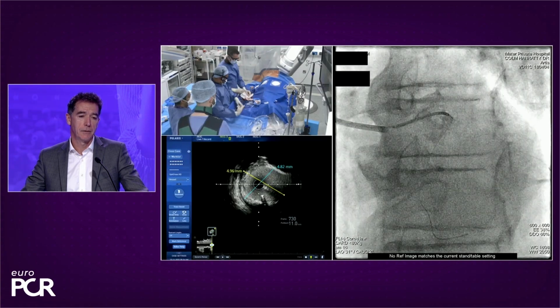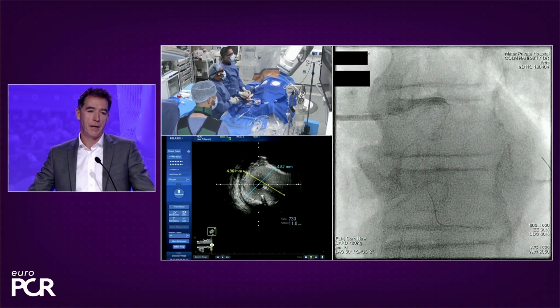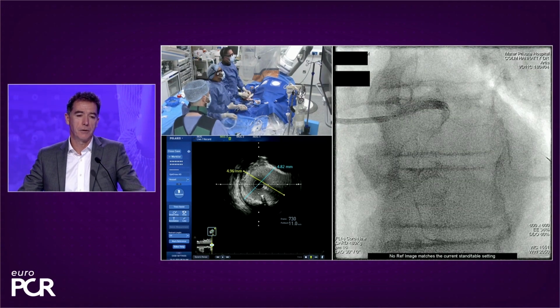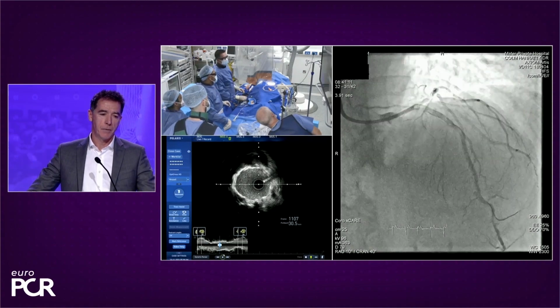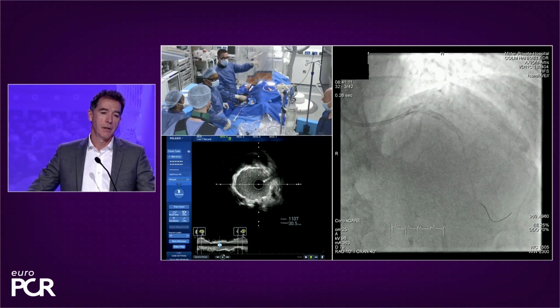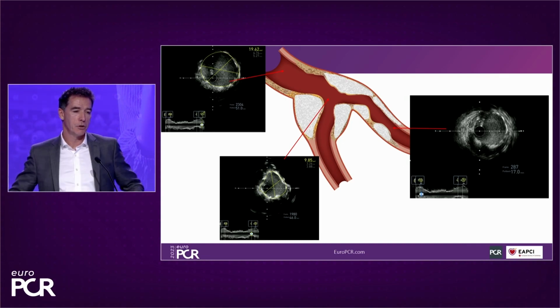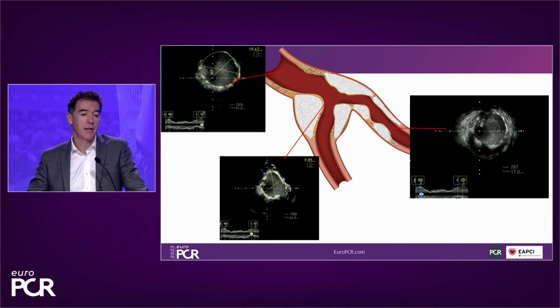After that, we put in our stent. So this is a 3.5 by 32 Megatron. We need another stent at the distal edge, which I'll show you. Performed our POT. This is the angiogram and the intravascular imaging, and it showed that we got a very good result, an area of 10 millimeters squared at the ostium of the LAD at that very tight area of 19 in the left main, and a very good distal edge.